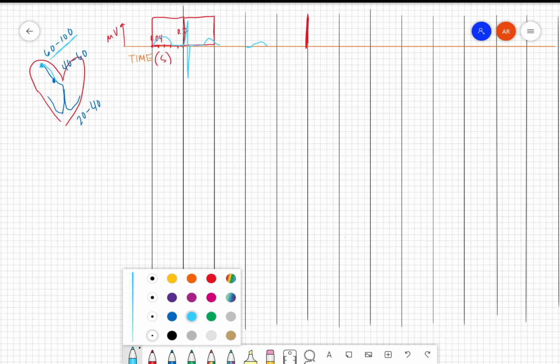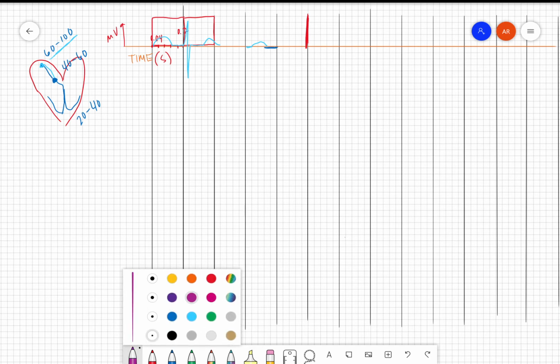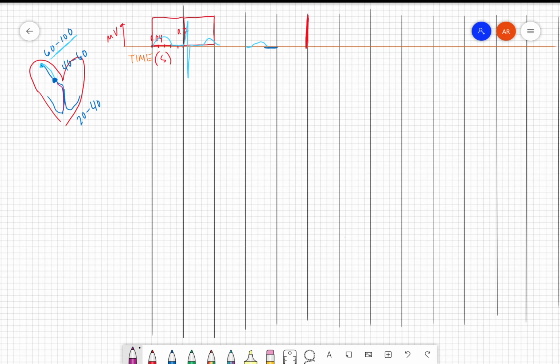You remember from lecture, the AV node slows that signal down so that the atria can contract. So when we have that pause in the electricity firing, the atria is contracting. We've got a pause that's established here on our timeline, and so the electricity is basically just stuck in this AV node for the time being. Once that electricity gets down into the bundle of His and starts going down into the bundle branches and into the Purkinje fibers down to the ventricles, we're then going to see what the electricity looks like as it's coming down.